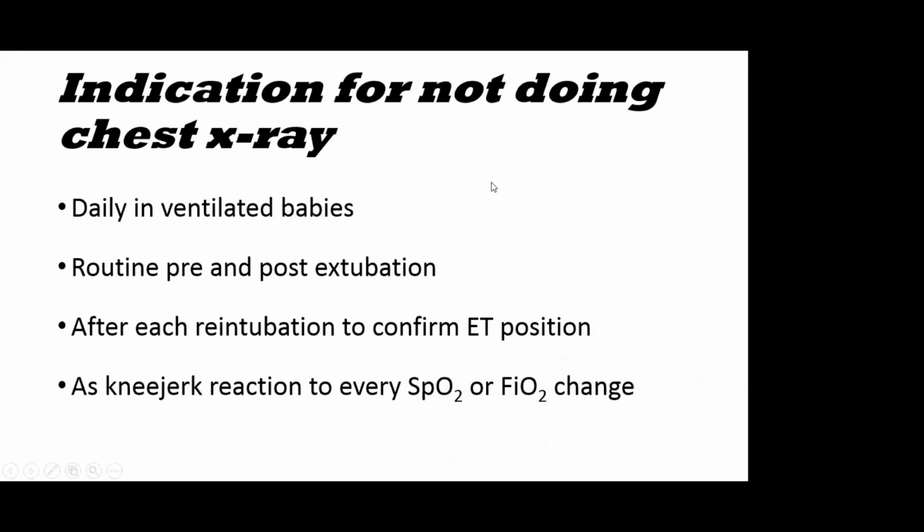Overall, see to it that even radiation as simple as an X-ray is not so safe, and try not to do an X-ray when it is not indicated. These are indications for not doing a chest X-ray: daily in ventilated babies as a routine, pre and post extubation, after each reintubation to confirm ET position, as there are so many papers now about POCUS. There are so many clinical methods identified to confirm ET position and whether the ET tip is at the right place or not. And more or less as a knee-jerk reaction to every SpO2 or FiO2 change.